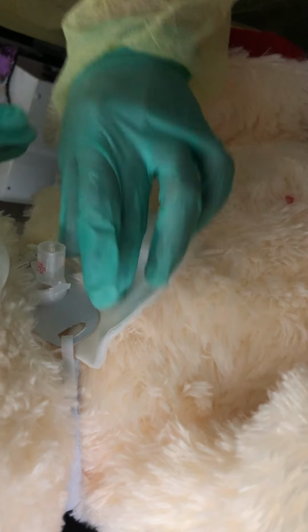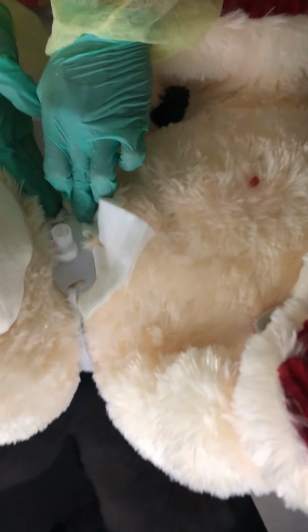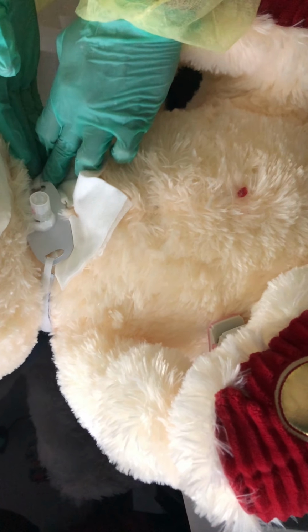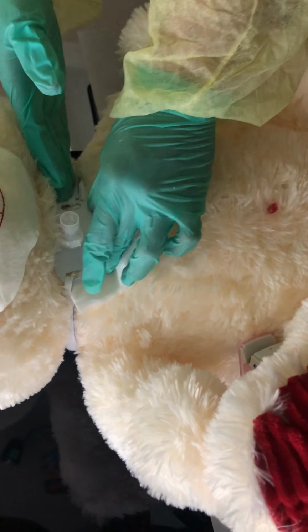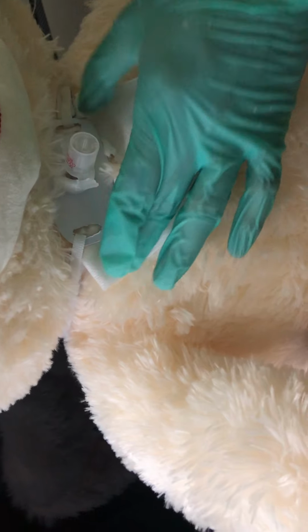Make sure it's stabilized. Keep pushing it. Make sure I don't leave any creases. Creases cause skin breakdown. And at this point, I'm going to say it's good.